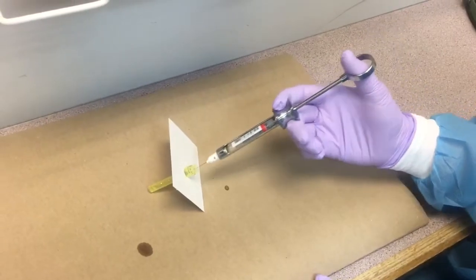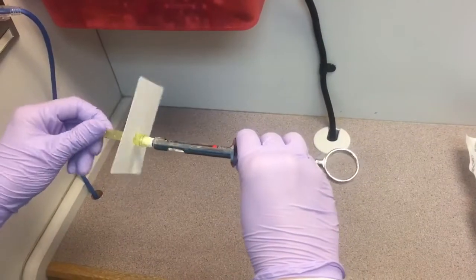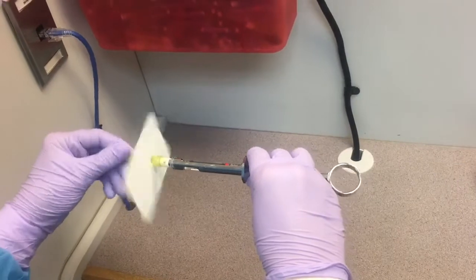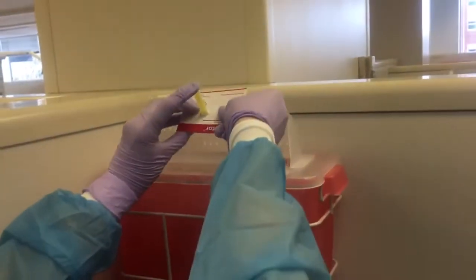When you are finished administering local anesthetic, use the one-handed recapping technique. To remove the needle, twist the cap on the opposite side of the card and push the cap with the needle through to the sharps container without the card.